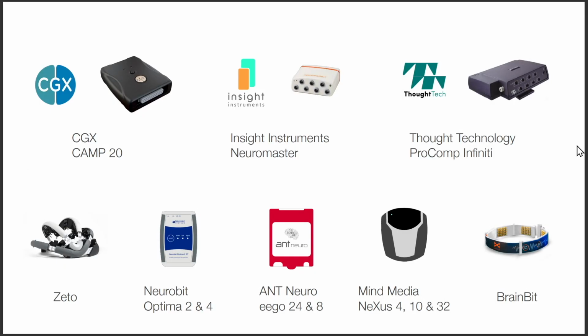All right. So let's start. As always, we have a lot of hardware connected, and we are working closely on another hardware that will be connected shortly. Hello, one more joined. We just started. So we have a lot of hardware connected to our BrainAssistant. If you know another hardware manufacturer that might be interesting to connect to our software, of course, you can give us the contact and we can see what we can do. There's one other hardware manufacturer we're now working closely together with that might be joining that list, so stay excited.